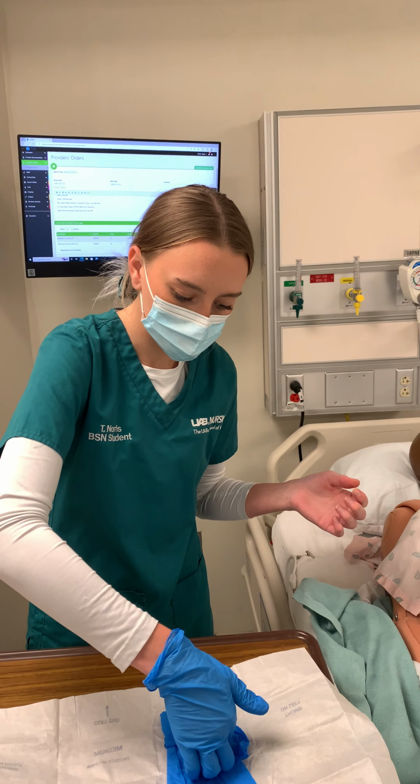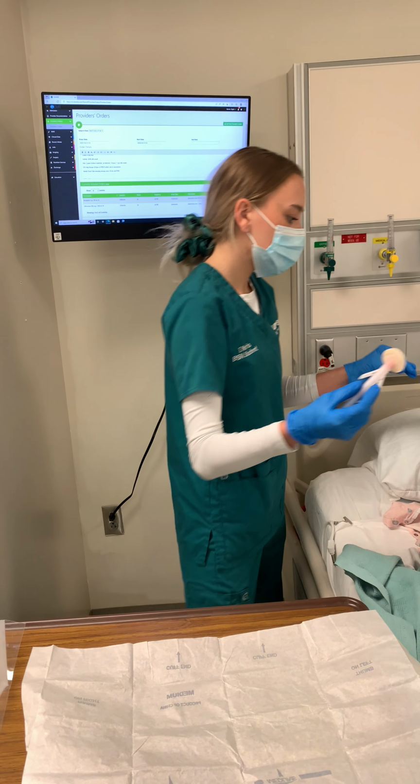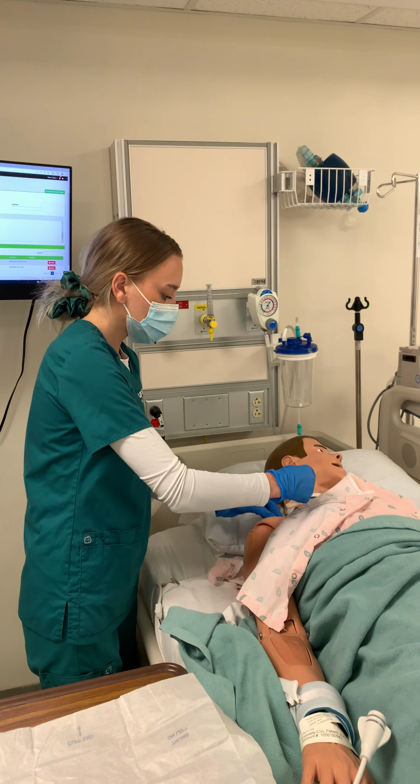So now I'm going to get the chlorhexidine and go ahead and clean my patient. We're going to use a back and forth motion and secure the catheter if needed to make sure it doesn't become misplaced. All right, then we'll dispose of that appropriately. I'm now going to grab my new dressing from the pack, and we're going to go ahead and apply this over the insertion site.